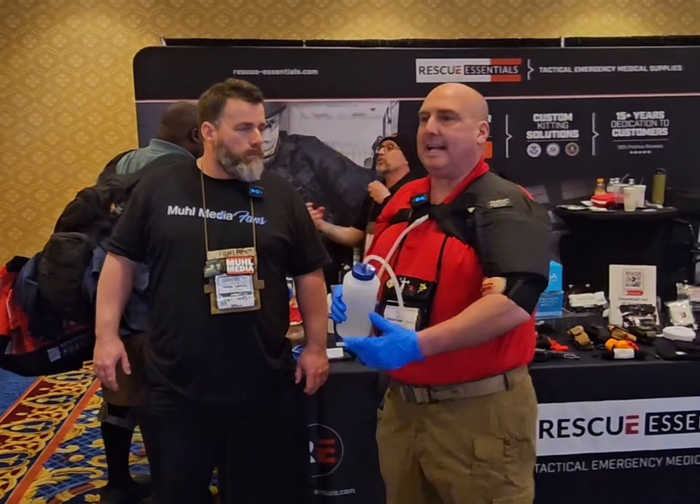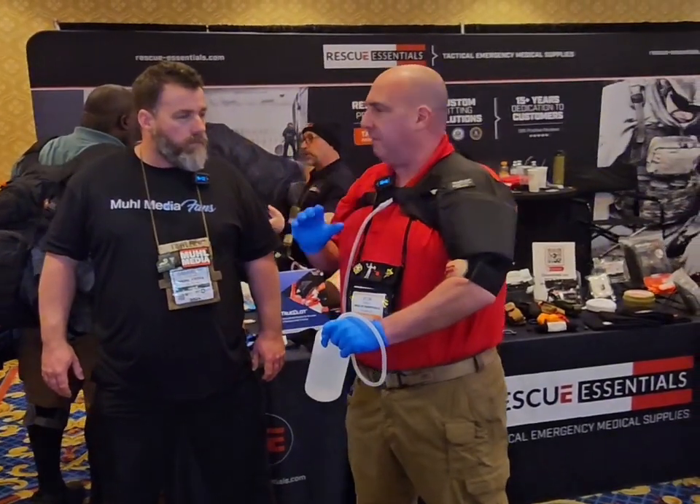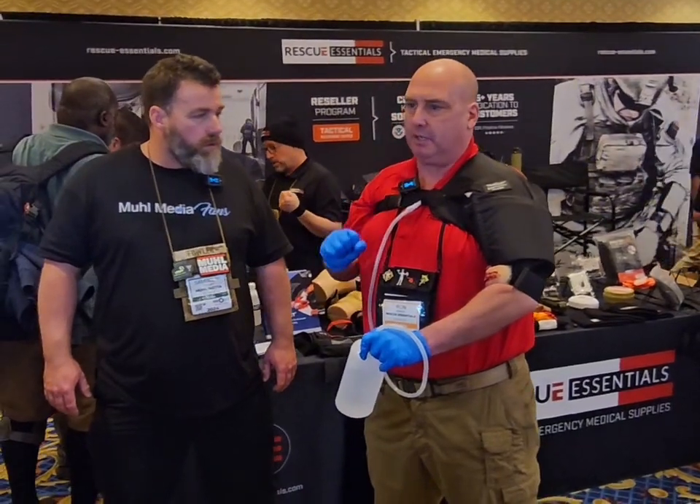Thank you, Sam. So our tourniquet application trainer — we call it the TAP for short — is designed to make sure that we are focusing on good, solid tourniquet training.